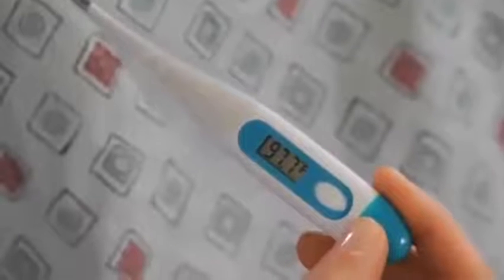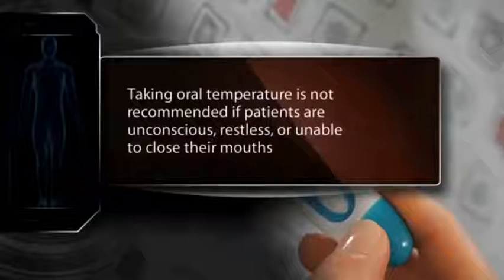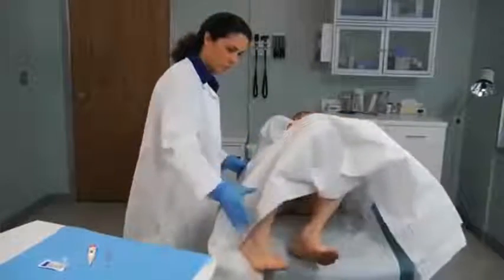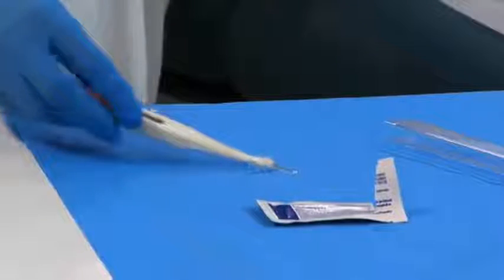Most patients prefer oral to rectal temperatures. However, taking oral temperatures is not recommended if patients are unconscious, restless, or unable to close their mouths. In these cases, rectal temperatures are advised. For a rectal temperature, ask the patient to lie on one side with the hip flexed. Lubricate the tip of the thermometer.